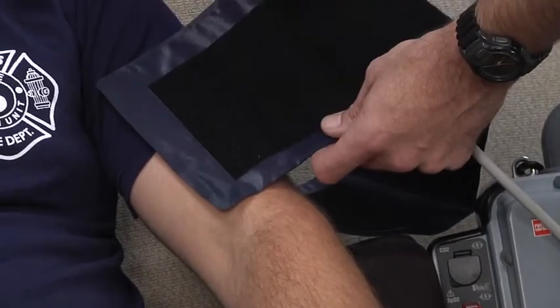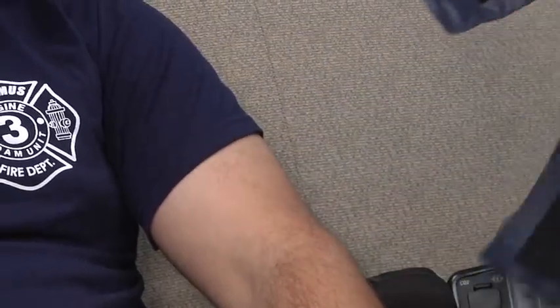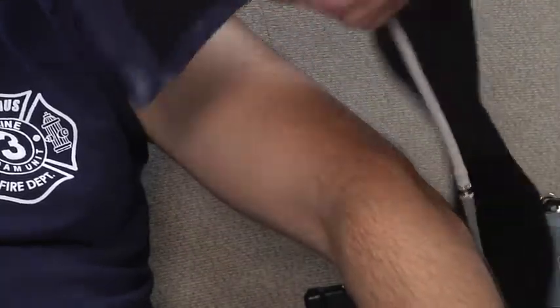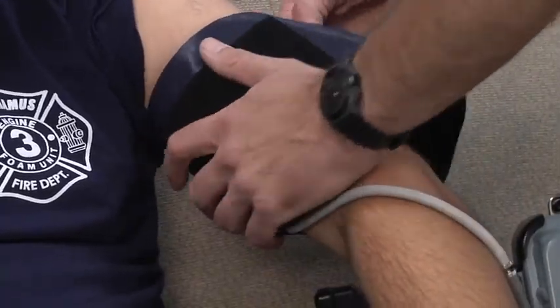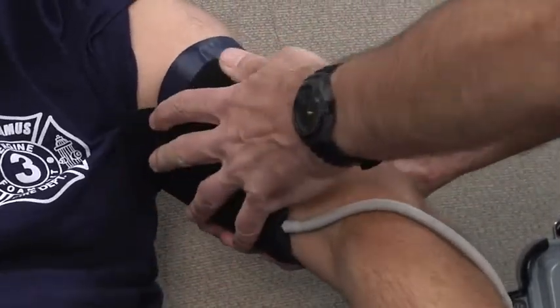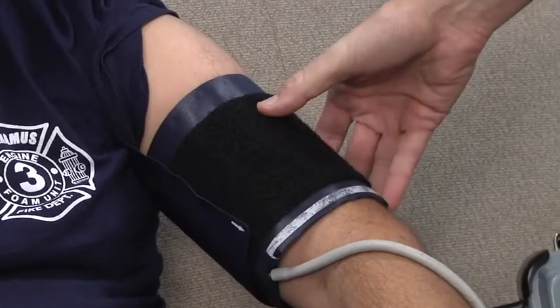In this patient, we selected a cuff whose width is two-thirds of the distance between his shoulder and his elbow. We're going to move the shirt so that the cuff is on skin, place the bladder around the arm, and secure the cuff so that it's snug on the patient's arm.